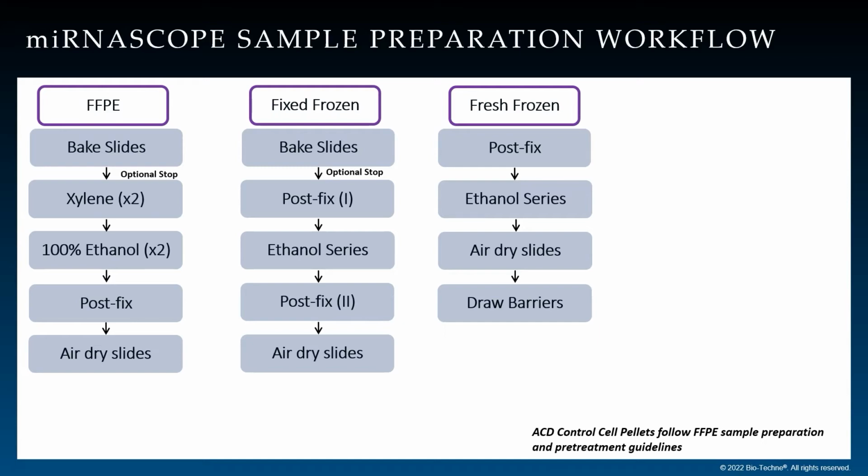The fixation time may need to be optimized for your samples. The slides are then dehydrated through a series of ethanol incubations, as for fixed frozen samples. The dehydrated slides are air-dried, and once the ethanol is evaporated, hydrophobic barriers are drawn around the sections.